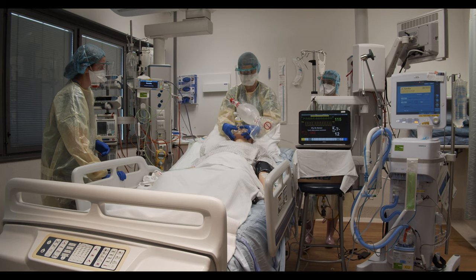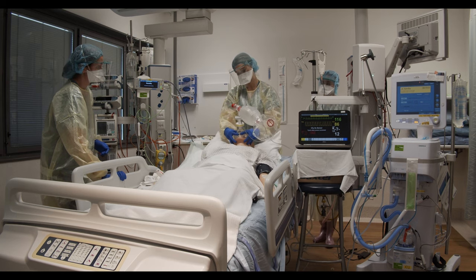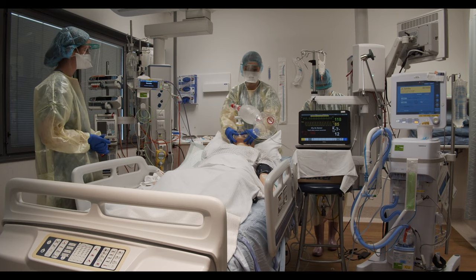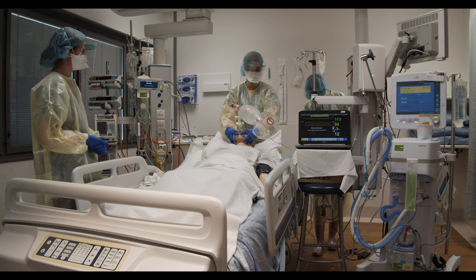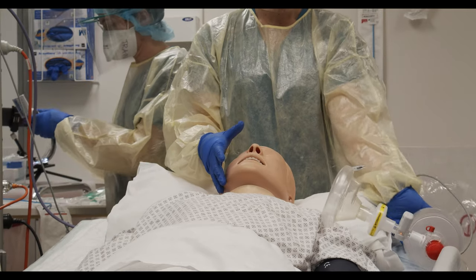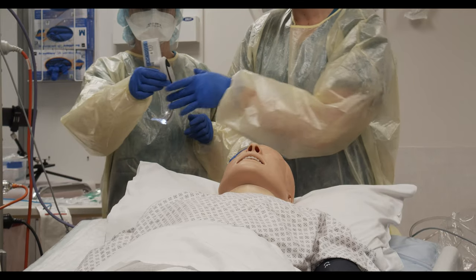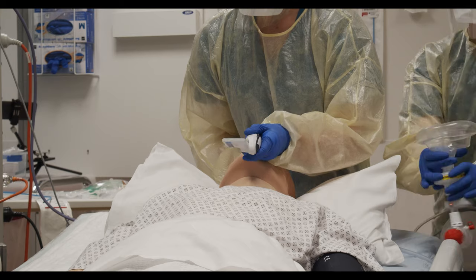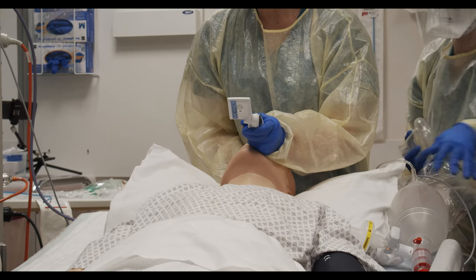Okay, that's good. Okay, and that's 1 minute off. Okay, so I'm ready to have a look. Kathy, you switch the oxygen off, please. So oxygen's off, thank you. And I'll take the video scope. Video scope on. Okay, that's 3, please.